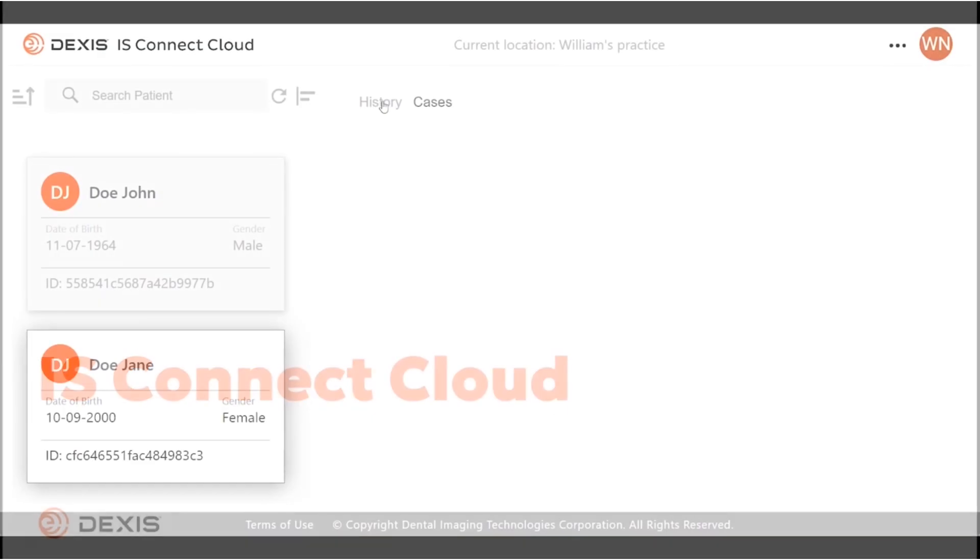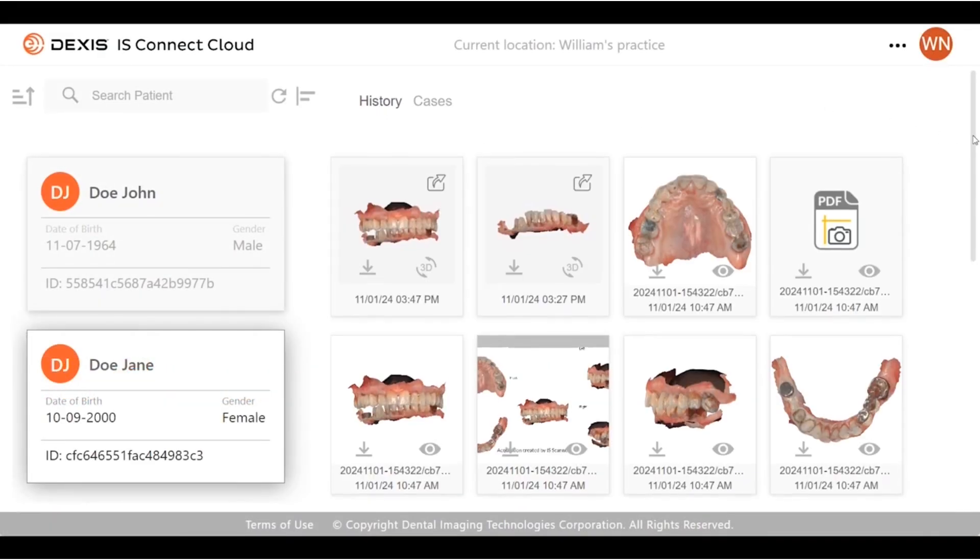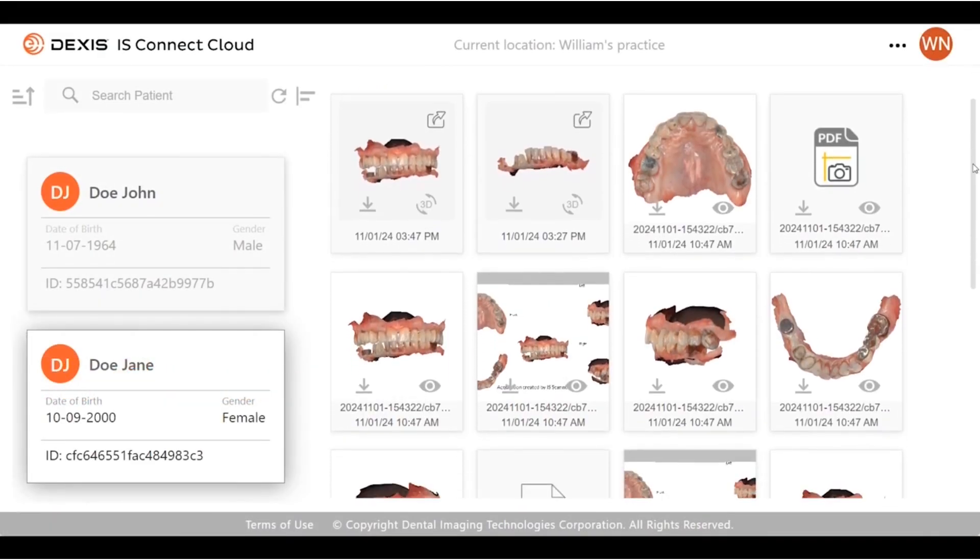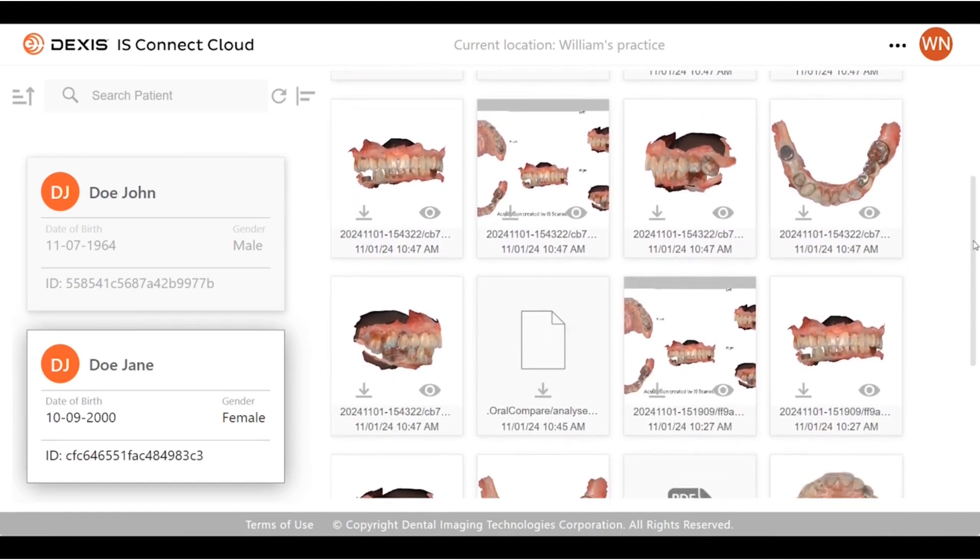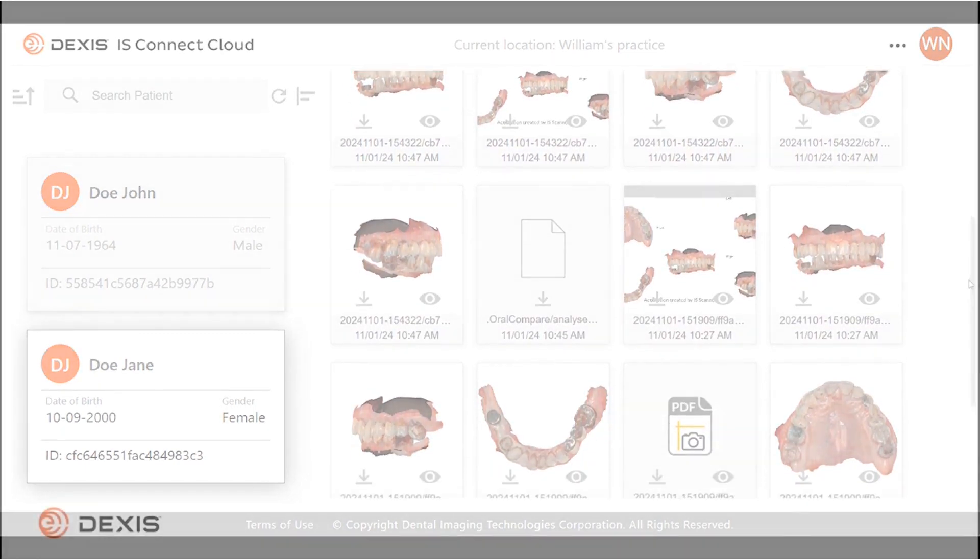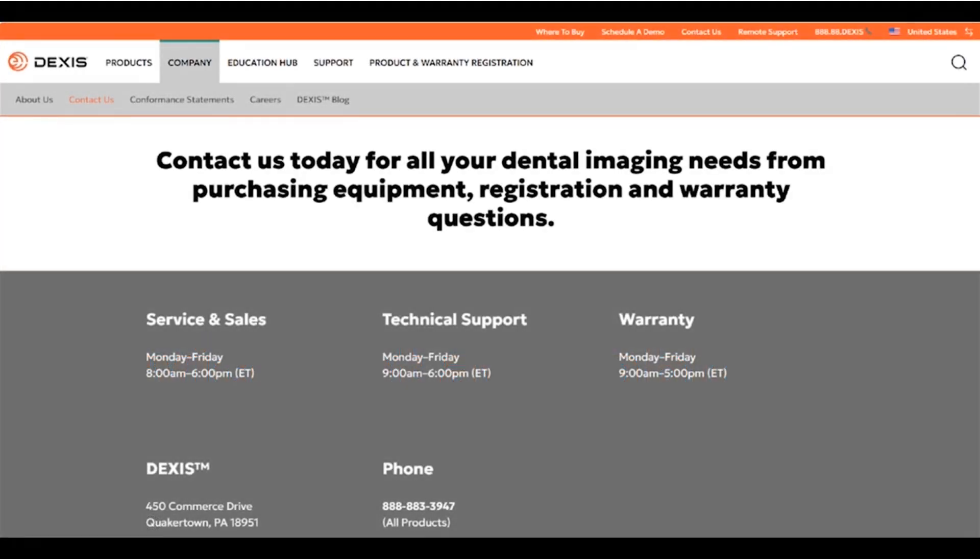Dexis IS Connect Cloud allows customers to access and view scans anytime and anywhere through a web browser. IS Connect Cloud is not available in all regions. Please contact your regional sales representative for more information.